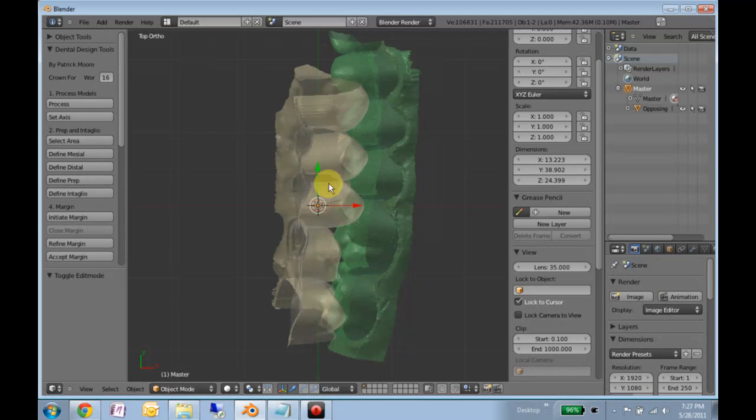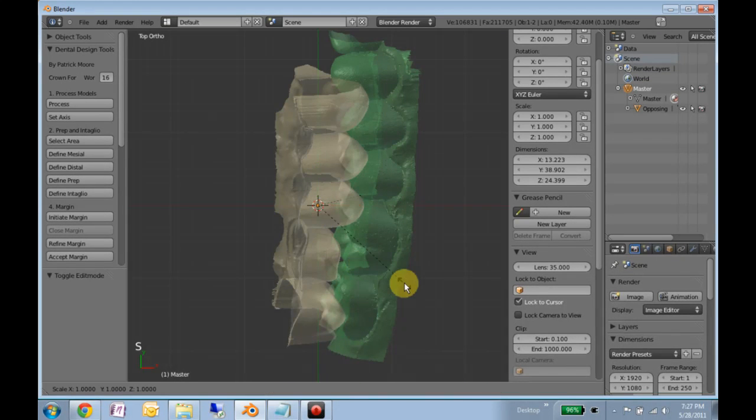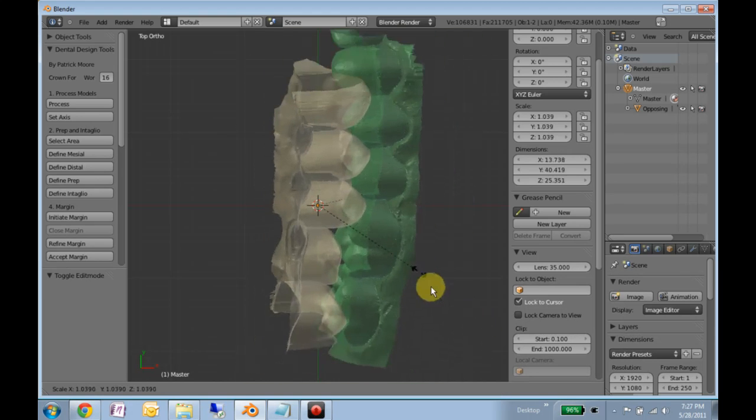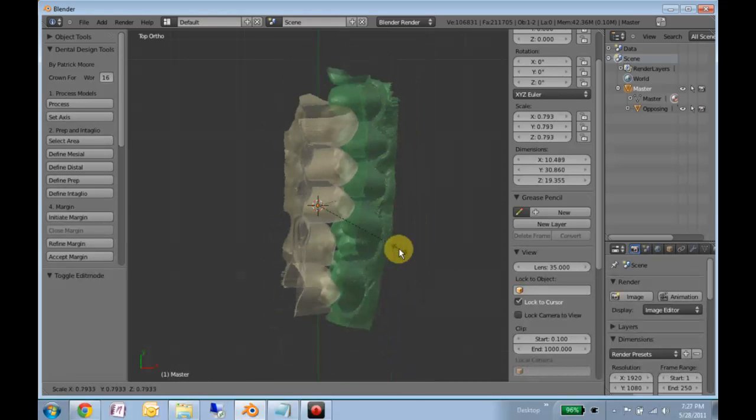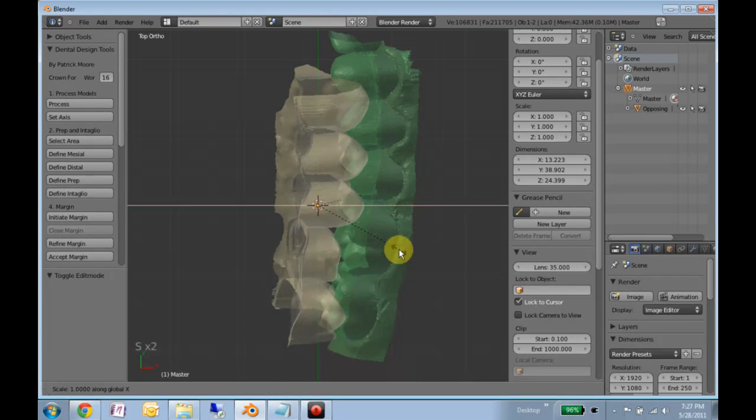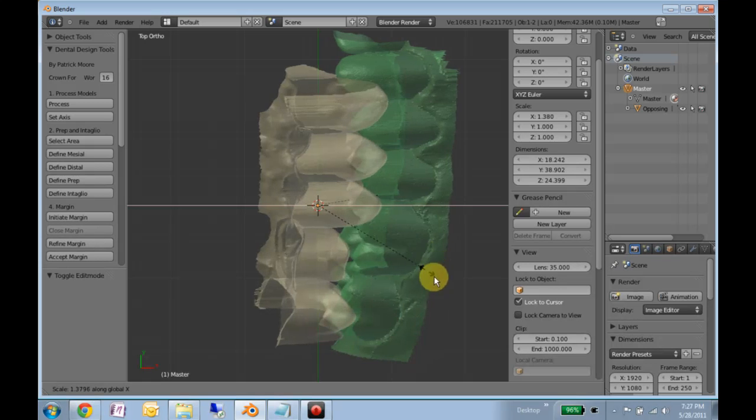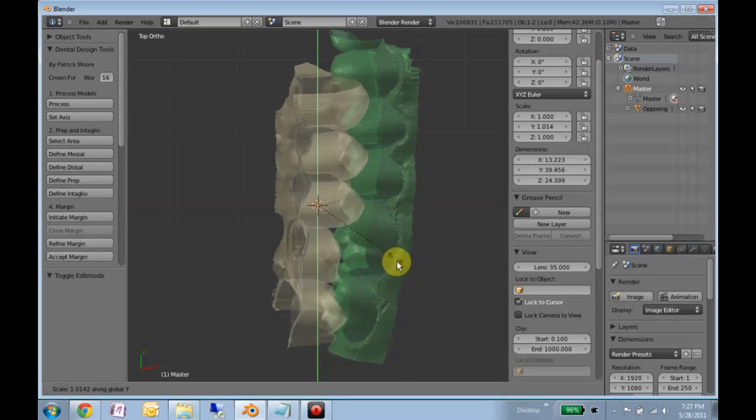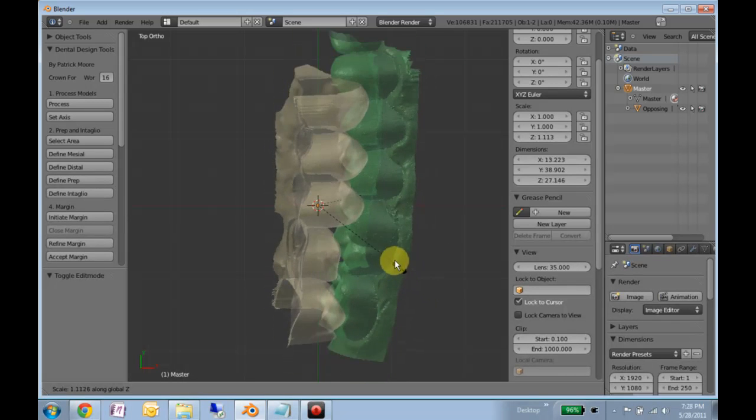You would never do this to the master model, but if you hit S, you can scale. And if you hit S followed by X, you'll constrain that scale to just the X axis, the Y, or the Z axis.